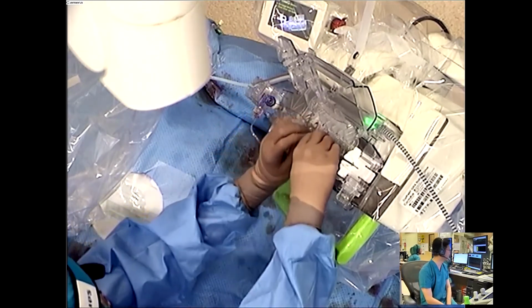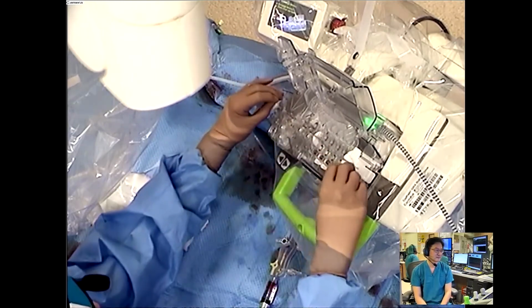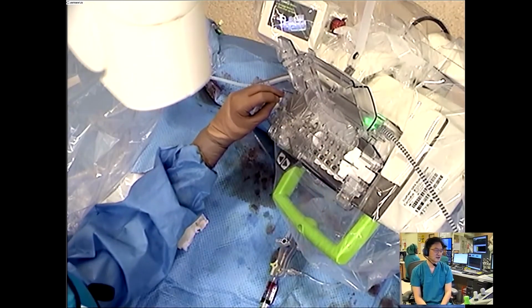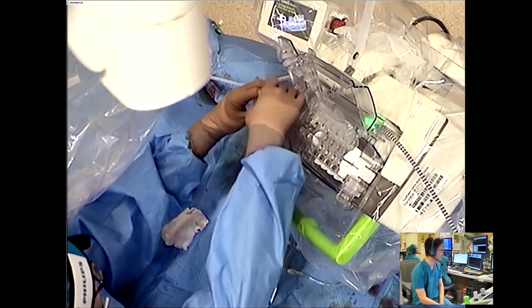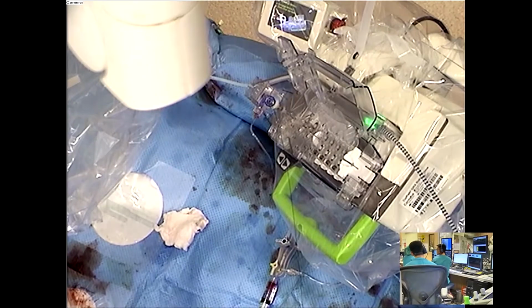Deborah, are we okay to do an IVUS? Because there's a bit of a jump at the lesion site, so I think it's probably a soft plug. Since we have plenty of time, I agree. Yep. Okay, so we will probably do a co-registration of the IVUS this time.